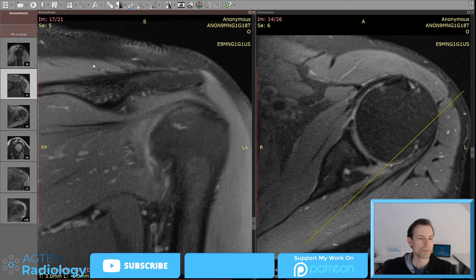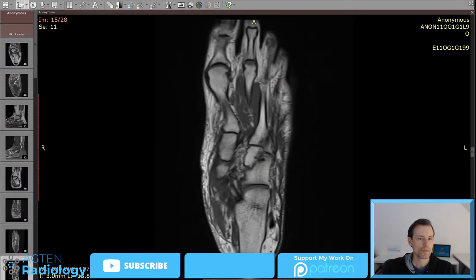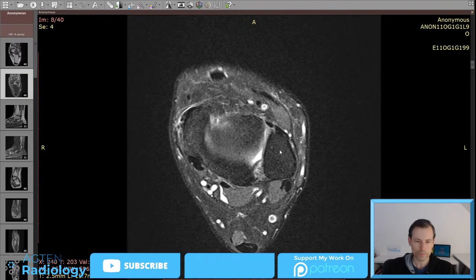I think that was a bit too long, maybe. Now, moving on to the last case, I think that's a very interesting one. It's a foot. It's a young guy, 30 something years old, and he had a previous crush injury and is now unstable. They just wanted to see what's going on. And I think the case has a few good points.